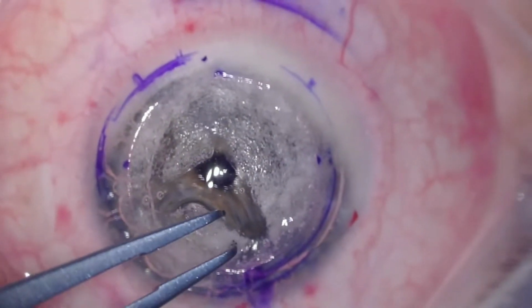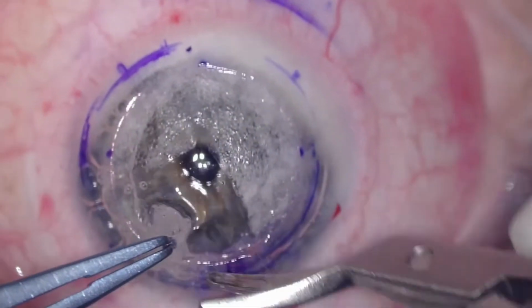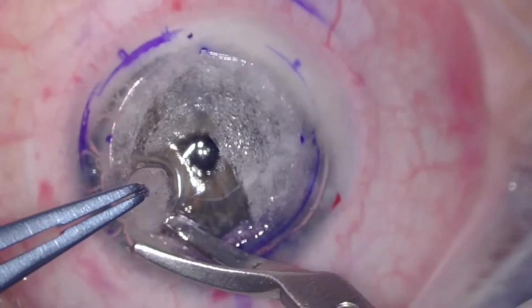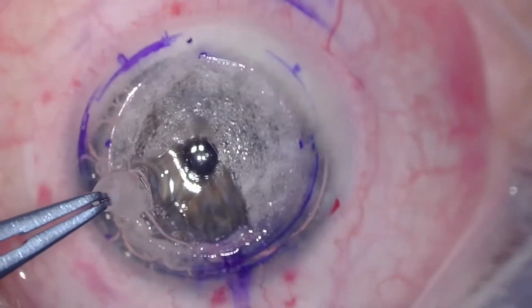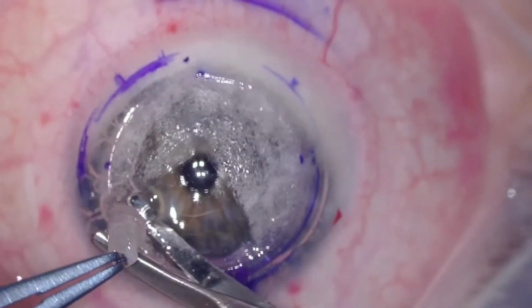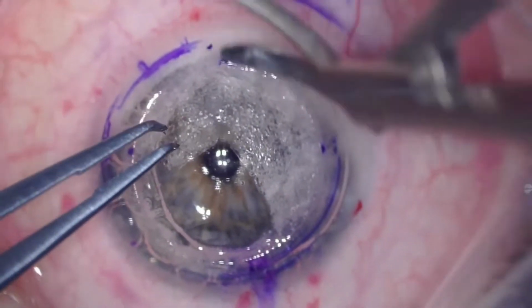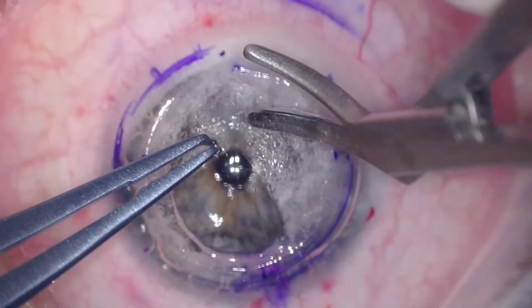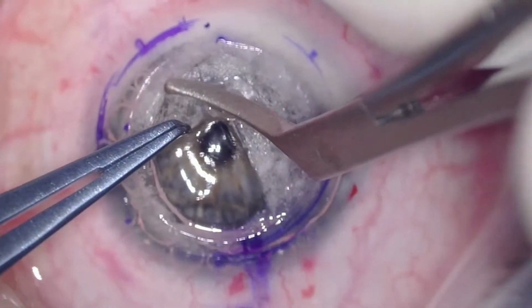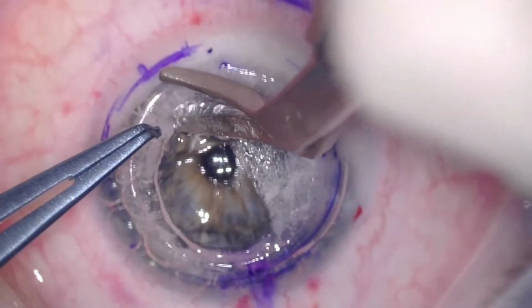up, and try your best to cut the stroma up against the wall of the trephine. Try and leave as little residual tissue as possible. You can see that amazingly clear Descemet's membrane underneath, which is maintaining that air bubble. So now I'm just cutting the second quadrant, being very careful not to drag the Descemet's underneath.